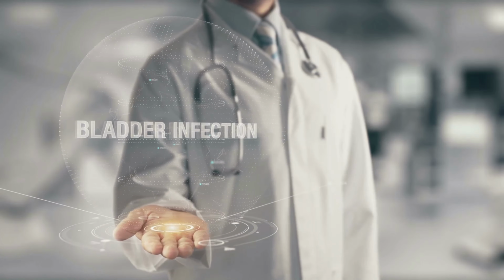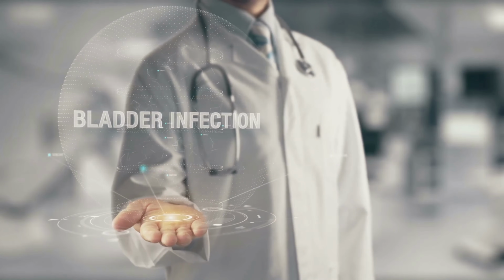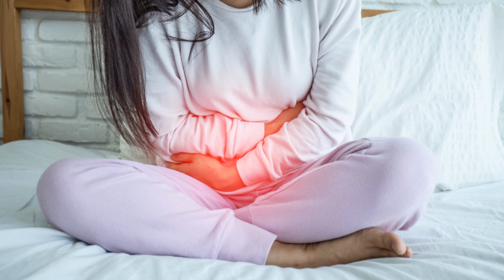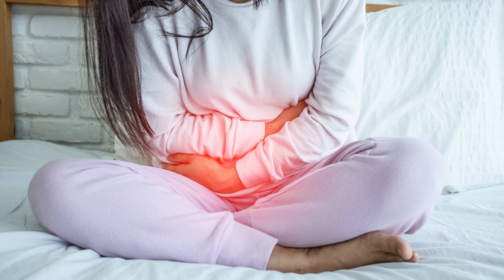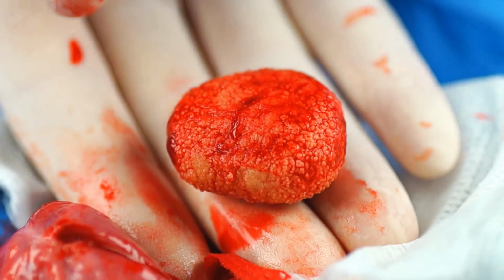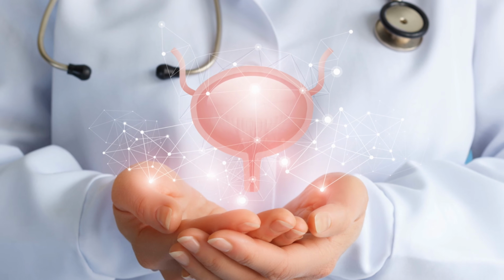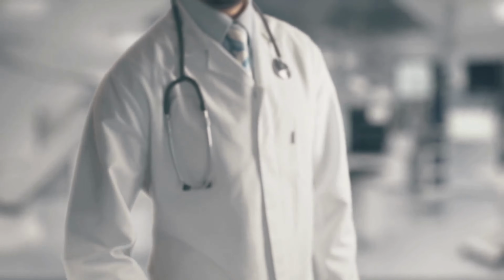Cystoscopy is performed for several reasons, including diagnosing bladder symptoms such as blood in urine, urinary tract infections, urinary incontinence, persistent pelvic pain, painful urination, frequent urination, or a feeling of incomplete bladder emptying. It's also used for treating bladder conditions like removing bladder stones, shrinking the prostate if enlarged, injecting medications like Botox for overactive bladder, repairing bladder damage, and taking cell samples for biopsy.